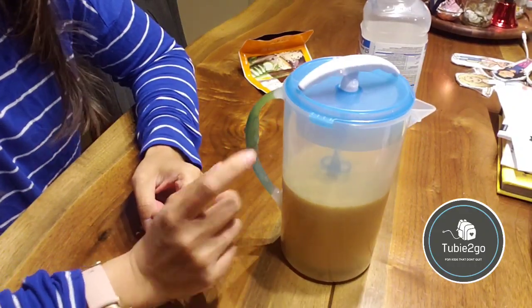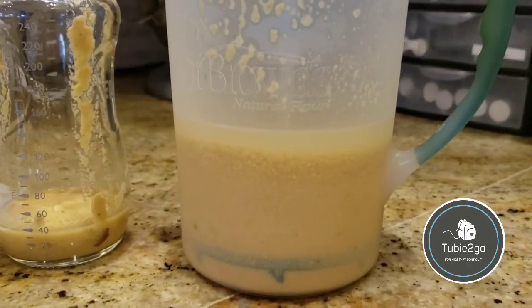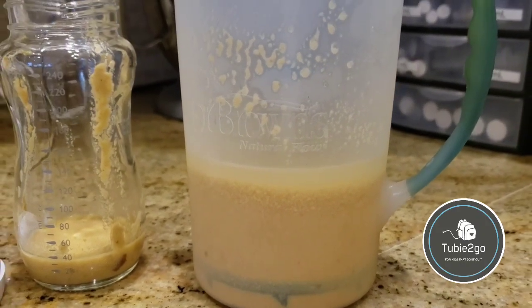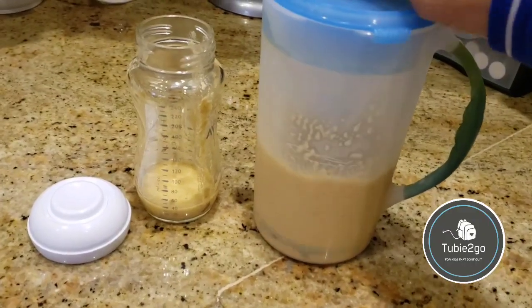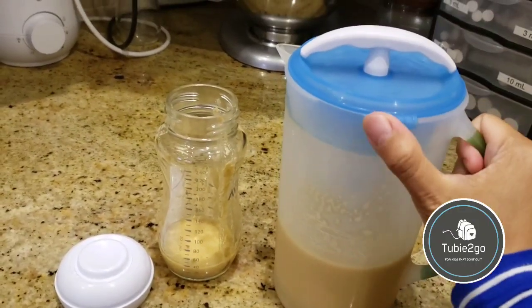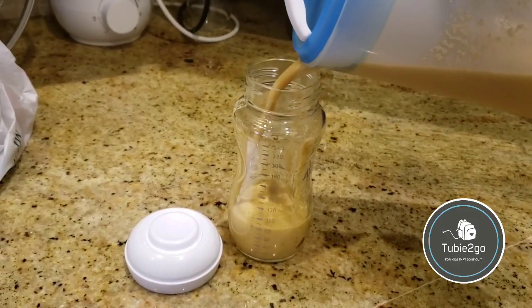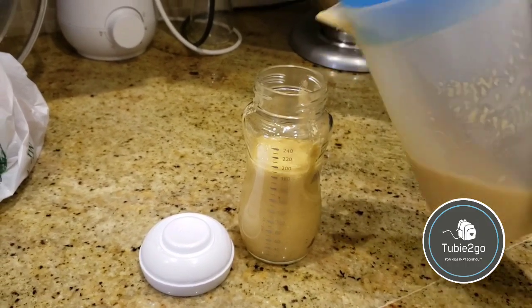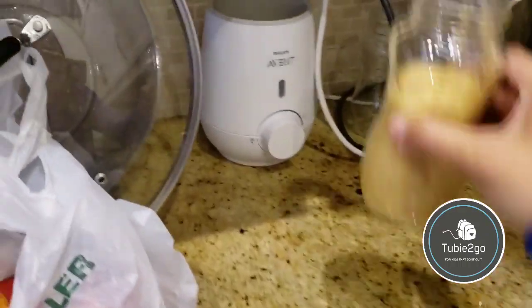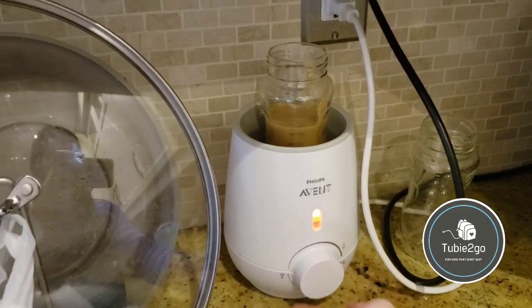I've taken this out of the fridge and you can see it's a little bit separated from sitting overnight, so I'm just going to mix it now. Then I can pour it into my eight-ounce glass bottles from Avent and stick it in the warmer.